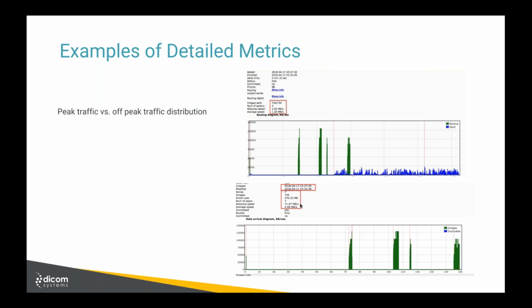And this is an invaluable tool for our troubleshooting. If we have imaging support teams on the call, I'm sure they get these as well: "Hey, my images were sent from the modality and they're not in the PACS." So where do we even begin to look at that? Right now, our first investigation step is to hit the DICOM router and look at these statistics and logs that are in the DICOM Unifier. Perfect. Thank you. Glad to hear that.